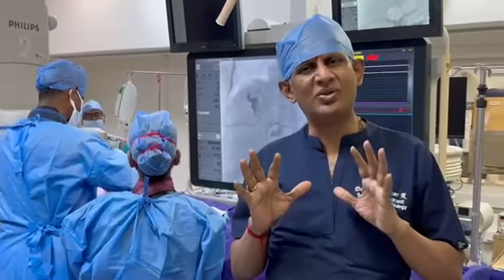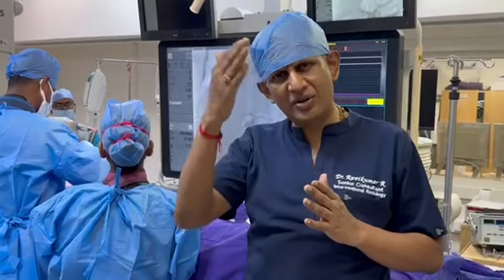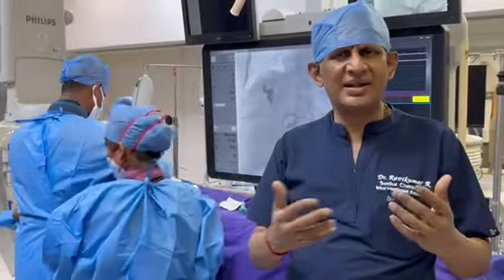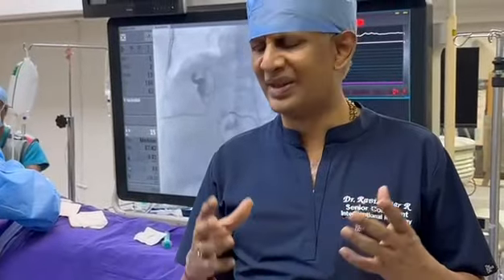But I invariably choose the left anterior ductal system because it is in line with the CBD, and to cross a lesion also it's easier. And I do both blind as well as ultrasound guided. Now and then, even the most experienced interventionist should try hitting the right system blindly, because more and more liver transplants are coming into the picture, biliary leaks are common, and when the ducts are not seen on ultrasound, you need to go in blindly. So when you keep yourself training for the right ductal system to puncture blindly, it will help you a lot.